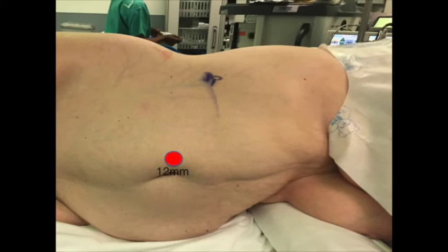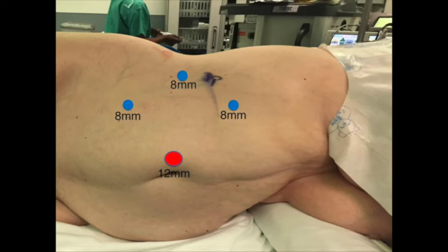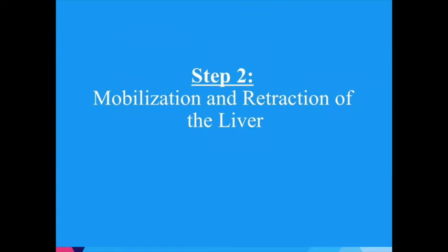The abdomen is insufflated with a Veress needle. A 12-millimeter camera port is placed peri-umbilically. Two 8-millimeter robotic trocars are placed along the mid-clavicular line near the costal margin and the iliac spine. A third robotic trocar is placed laterally near the iliac crest. A 12-millimeter assistant port is placed at the midline 5 centimeters caudal to the camera port. A 5-millimeter trocar is placed below the xiphoid process. Once all trocars have been placed, the robot is docked.